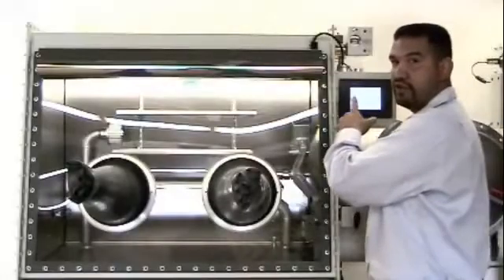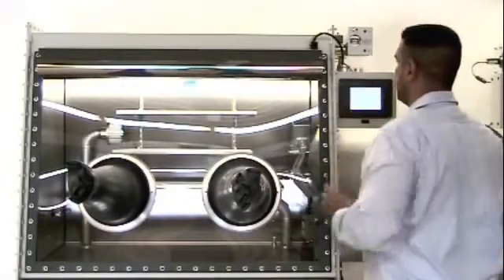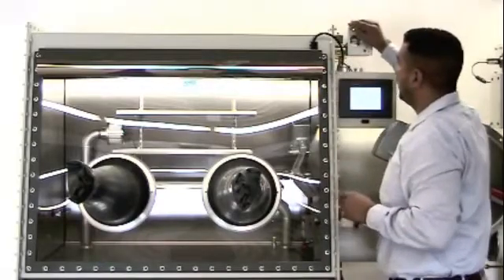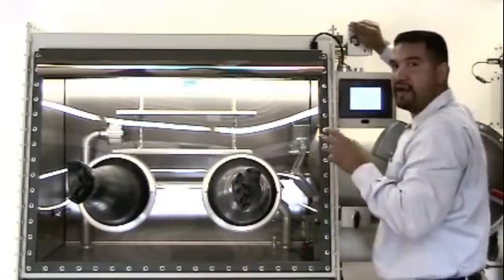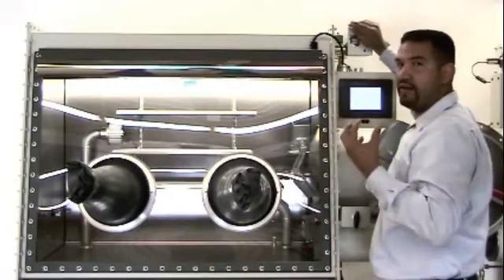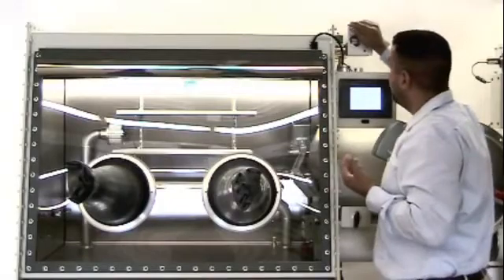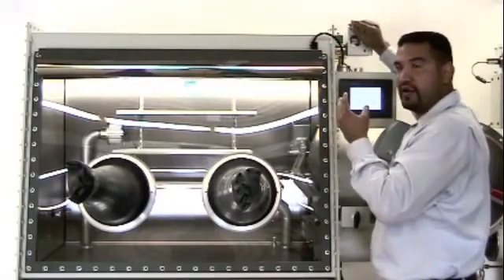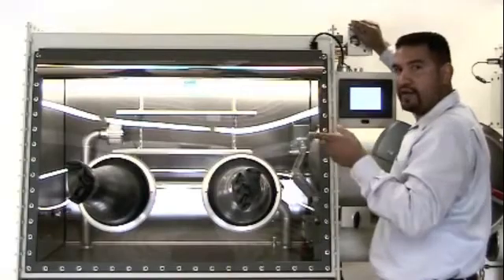Once the oxygen readings have stabilized, adjust your span potentiometer to 20.9 percent, which is the amount of oxygen in the air that we breathe. Turning the span potentiometer clockwise increases, whereas counterclockwise decreases.